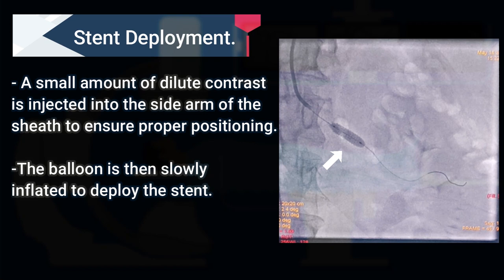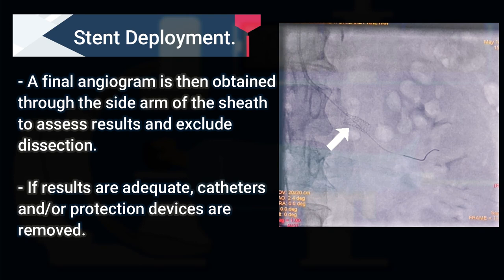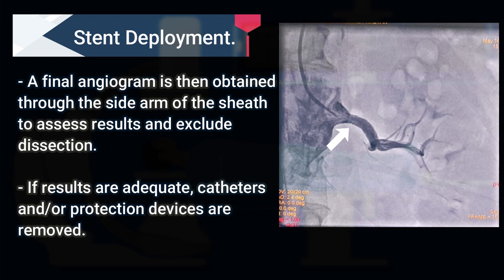Then the balloon is slowly inflated to deploy the stent into the renal artery. After deploying the stent, a final angiogram is obtained through the guiding catheter to assess the results and exclude dissection.